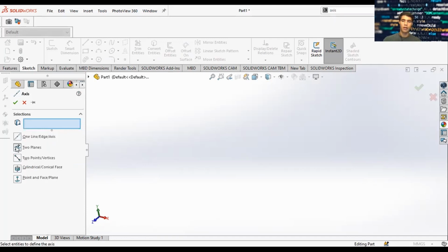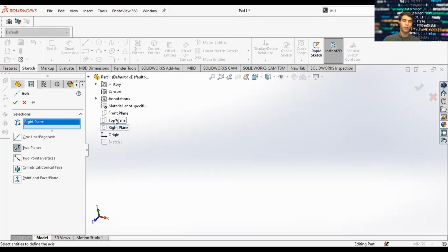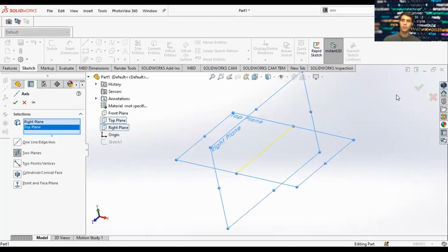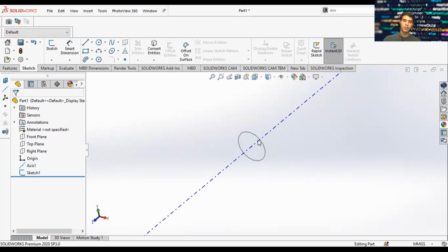In this case, we want to make an axis using two planes. There's two ways you can select these planes. You can select them in the graphics window, or you can select them on the left here in the tabs. We'll go ahead and make an axis from the top and right plane. There's your axis. If you zoom out, you can see it. And now we have our axis. We bring back our sketch and look at our sketch. There's our circle and there's our axis.